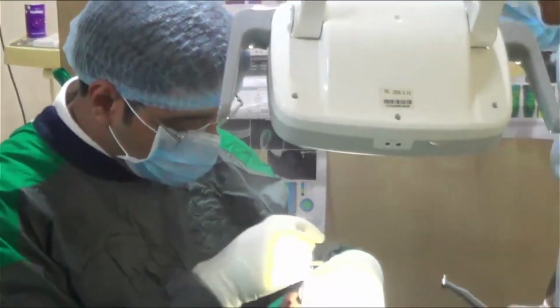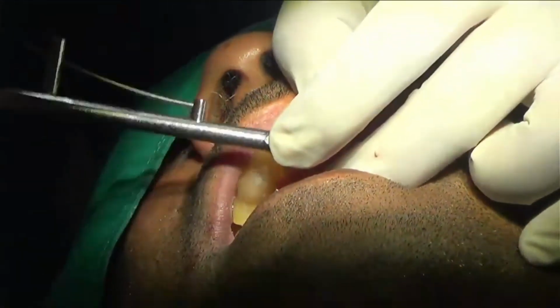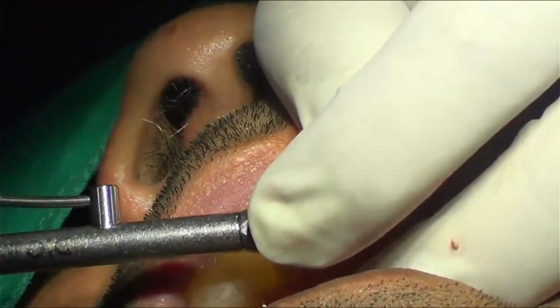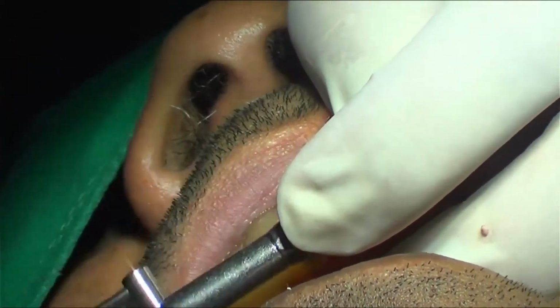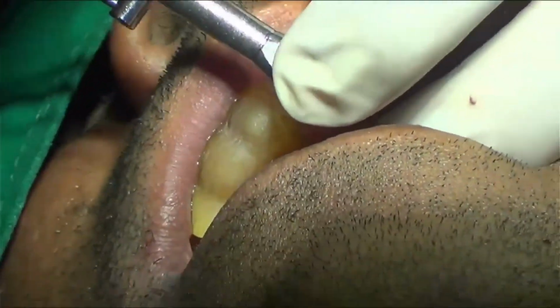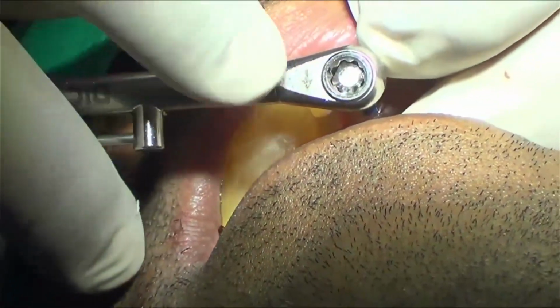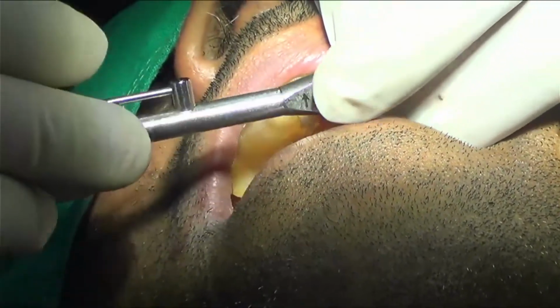So 1 drill, 2 drill, 3 drill, we are almost done. 4 drill, and with the 5th I have reached the depth. Still my implant torque is reaching 50. I would like to slightly detorque it. Wait again for a few minutes. I want to get it to an ideal torque of 35 Ncm.